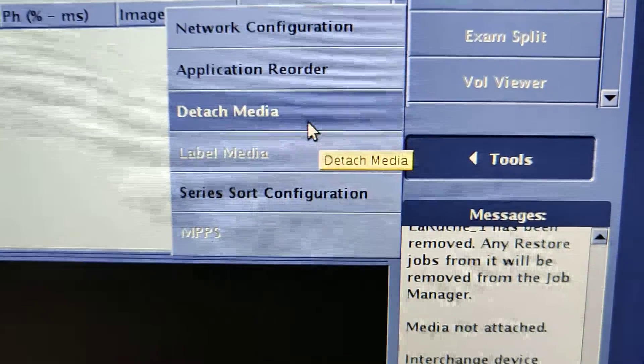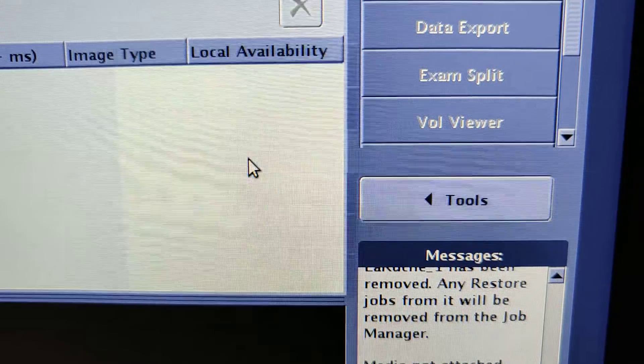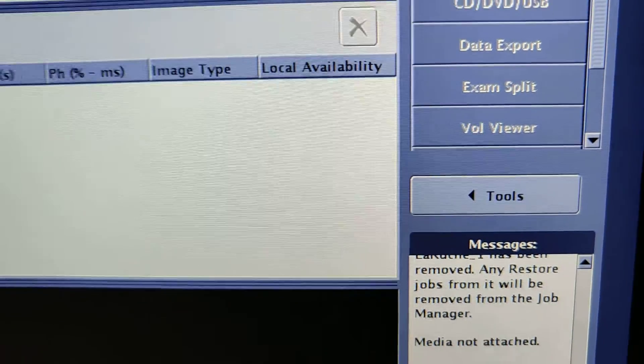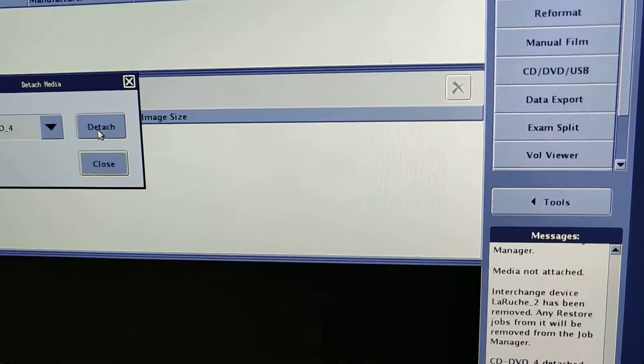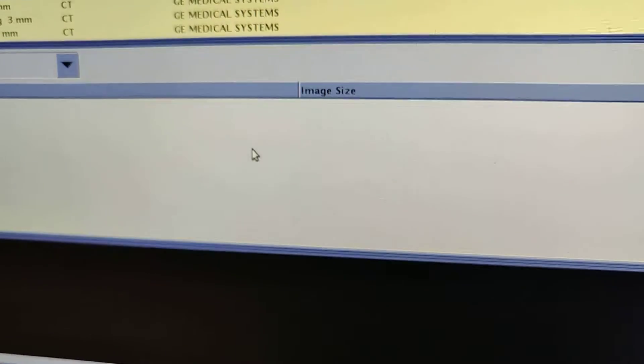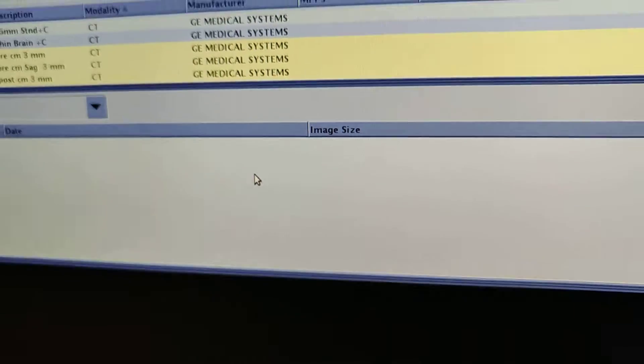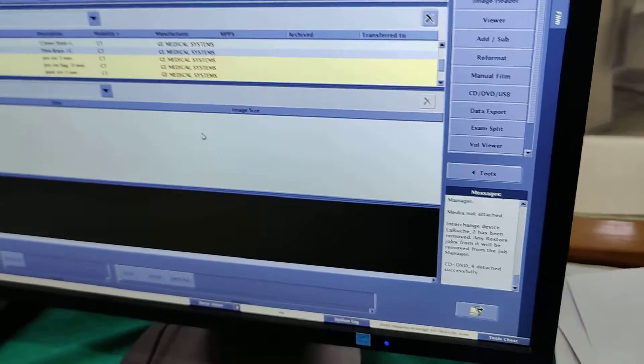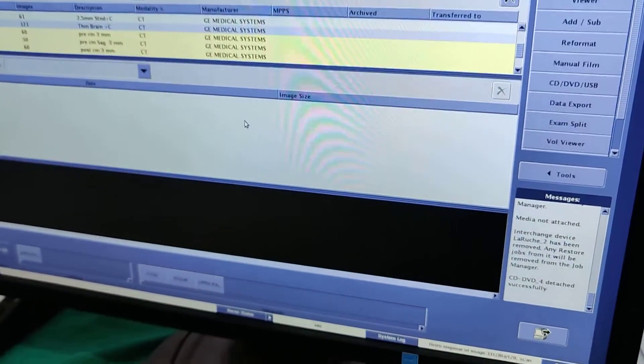And then to detach anything from the USB port, you have to go to the tools and then detach everything, and then you can pull it out the safe way, just like a computer.